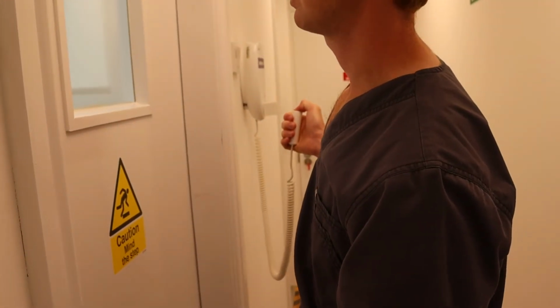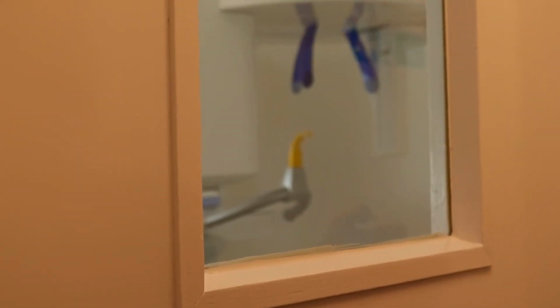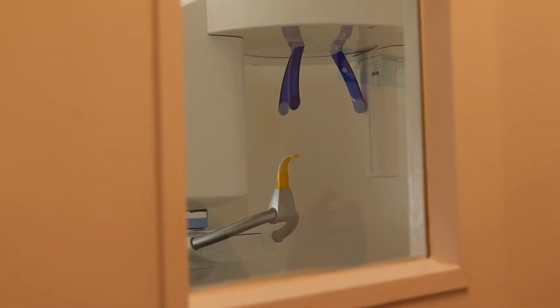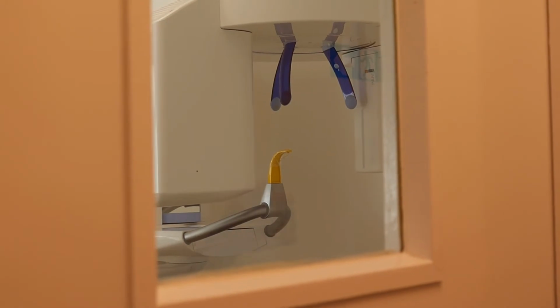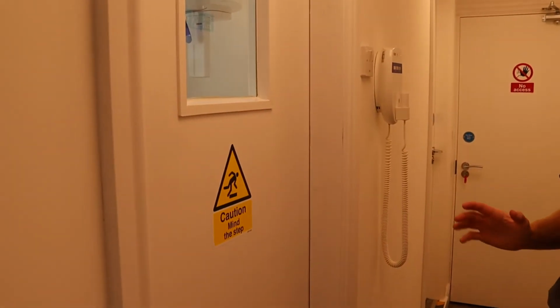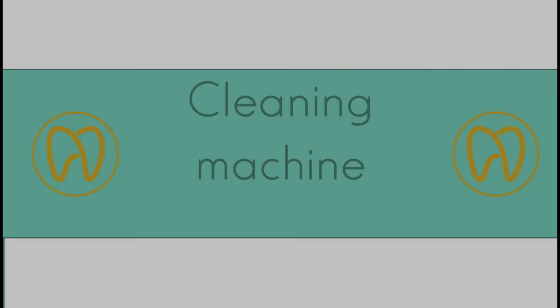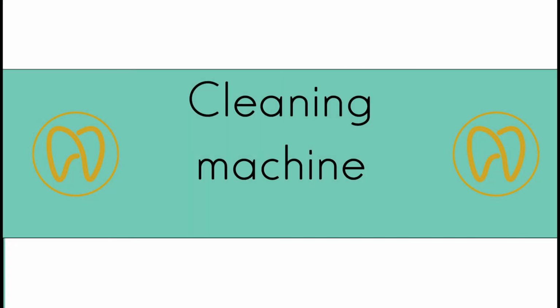The dentist will position the patient in the machine and also select the correct dosage based on the size of the patient, and then level them in the right position. The dentist then will stand at the window so he can keep an eye on the patient for positioning, and then press the button until the complete exposure is exposed. The nurse should stand at the door of the surgery and communicate that the x-ray is being taken.